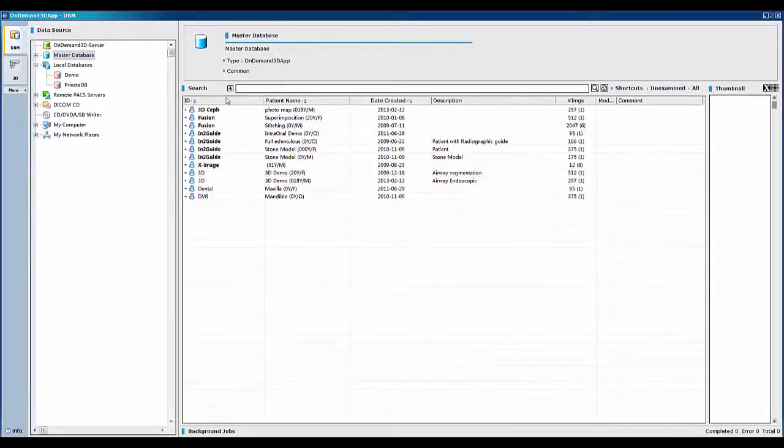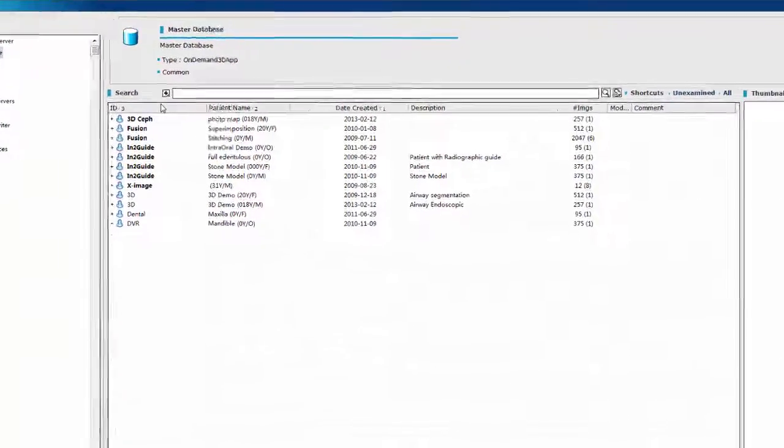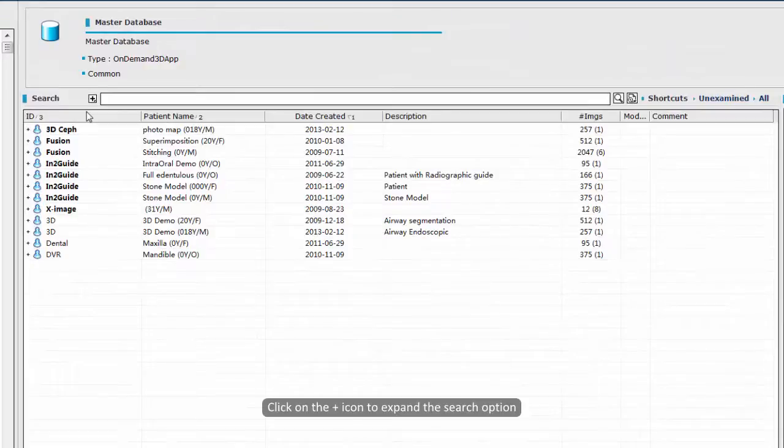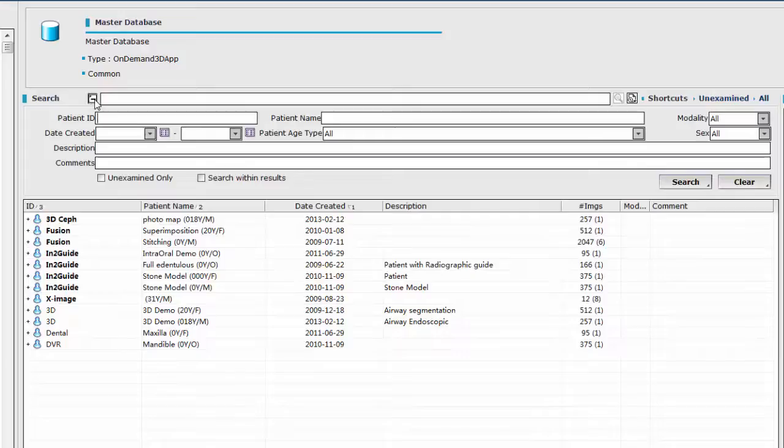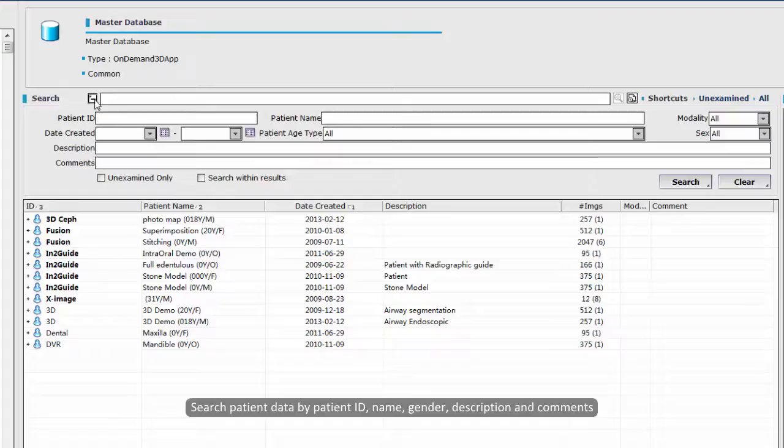Do you have too many data and would like to search through it easily? First, we will show you a few simple methods to simplify the data search process. Click on the cross icon to expand the search option. You can search patient data by patient ID, name, gender, descriptions, and comments.